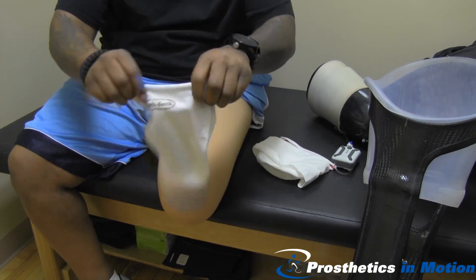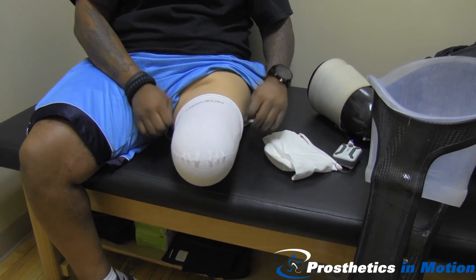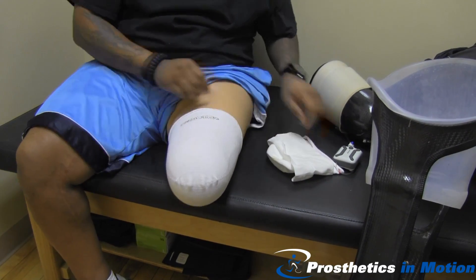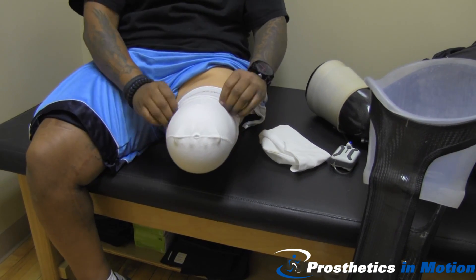His residual limb has decreased in size just a bit, so he's able to put some socks on. Then he'll put a sheath, and we'll watch him don the first part of the prosthesis.